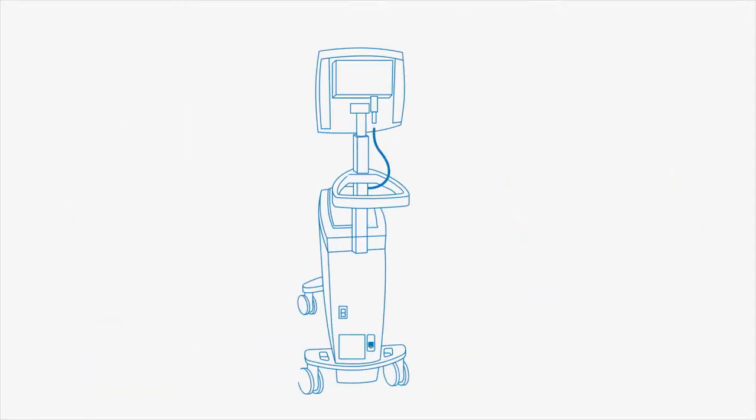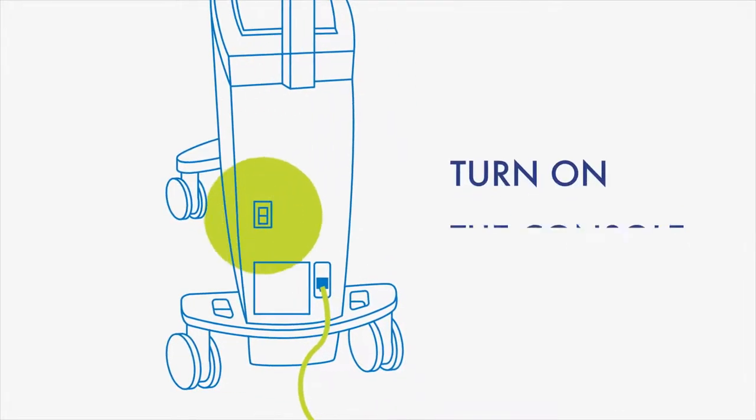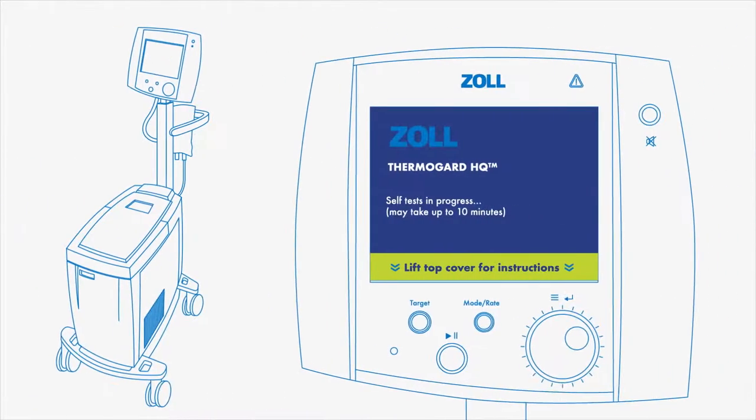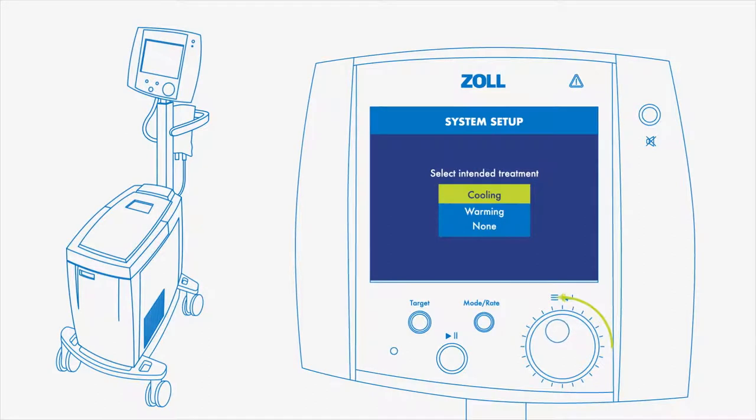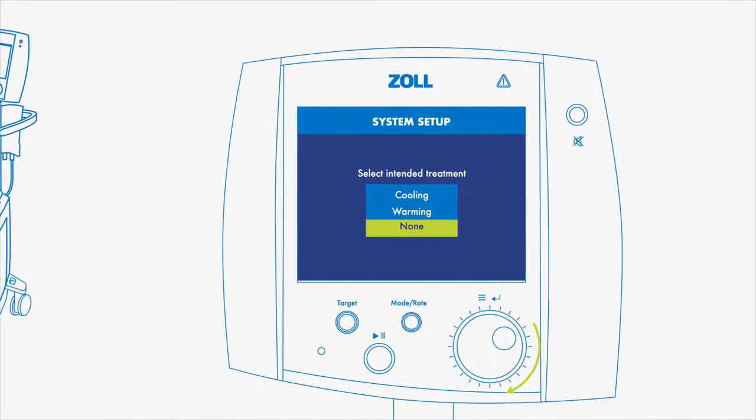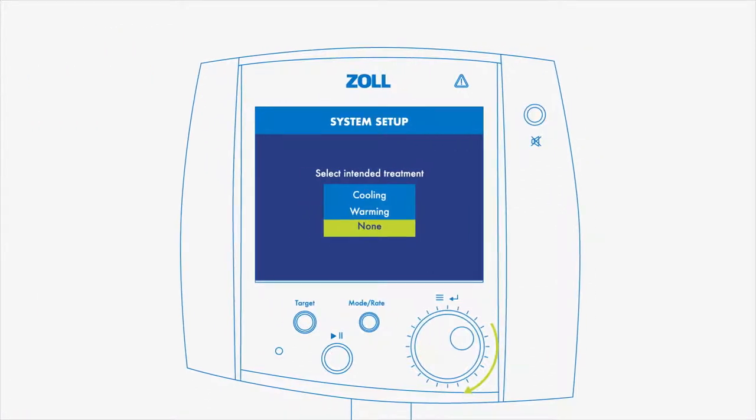Plug the ThermoGuard HQ into the wall socket and turn on the console. Rotate the dial to make a selection and push to confirm. Choose the treatment settings according to the desired application and in line with your hospital's own protocols.